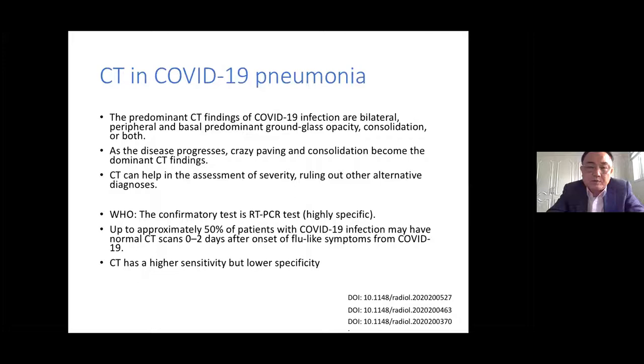Although WHO claims the only confirmatory test for COVID-19 is the RT-PCR test, which is very specific, CT can help in the assessment of severity and ruling out alternative diagnoses. But you know, CAT scan has higher sensitivity but lower specificity. That's the thing. But in Korea, we use CAT scan a lot. I will talk about that later.